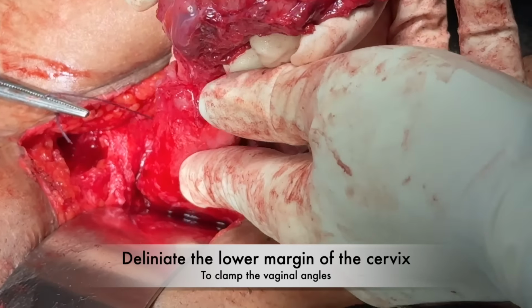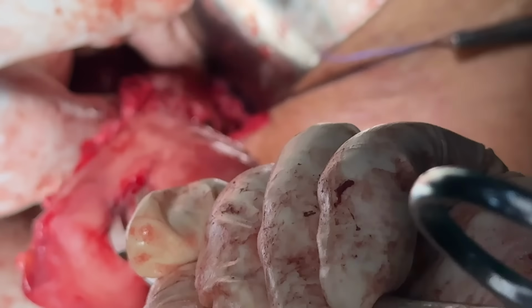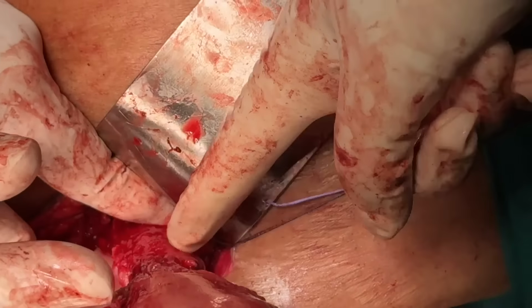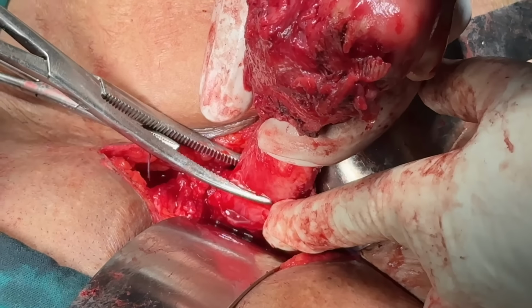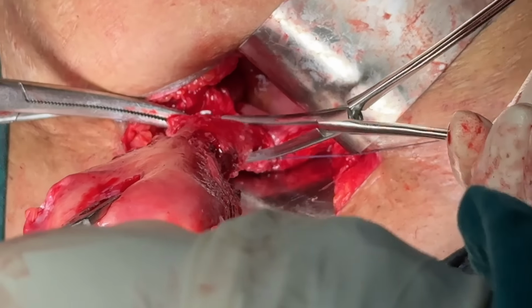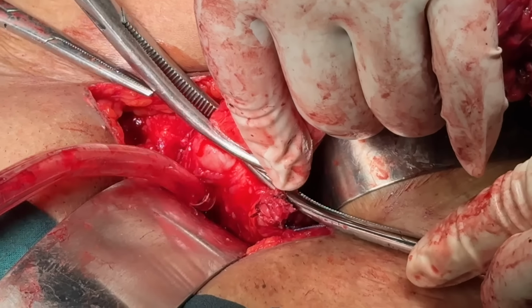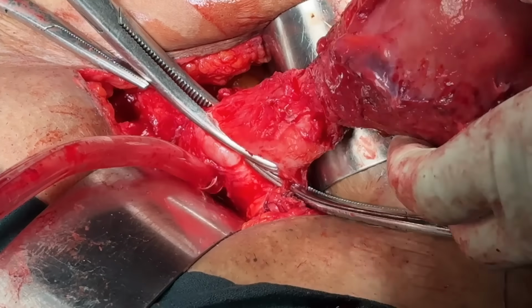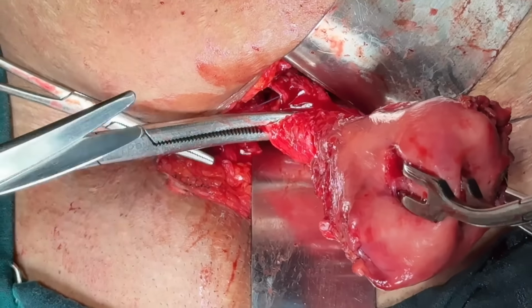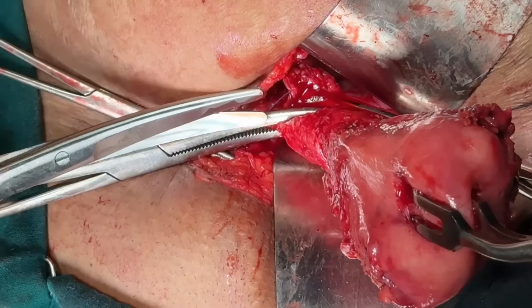After this, you must clearly delineate the lower margin of the cervix to be able to clamp the vaginal angles. One clamp on one vaginal angle and the other clamp simultaneously on the other vaginal angle. In one technique, in the simpler technique, you can overlap these 2 clamps and cut above the clamp bit by bit with the help of a nice scissors.